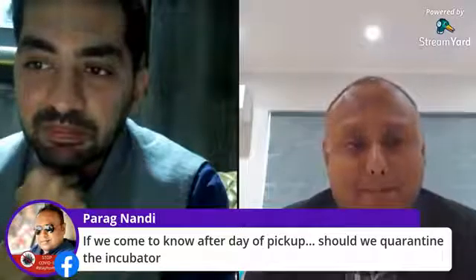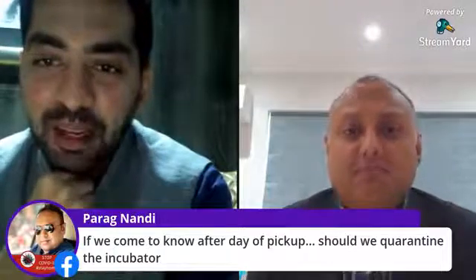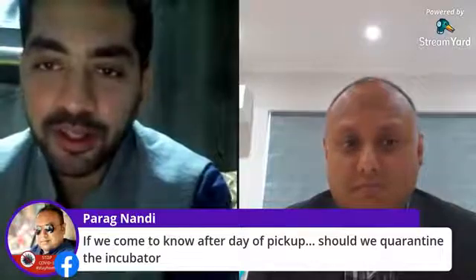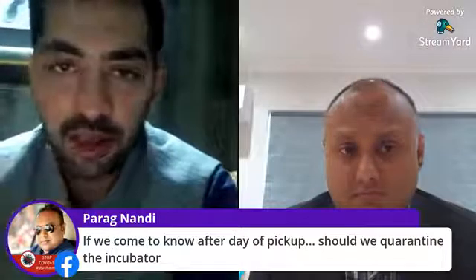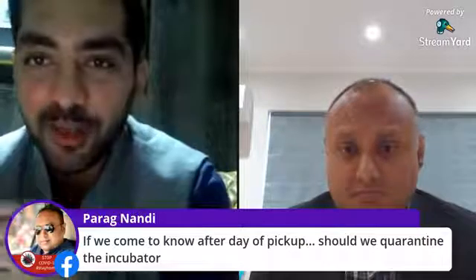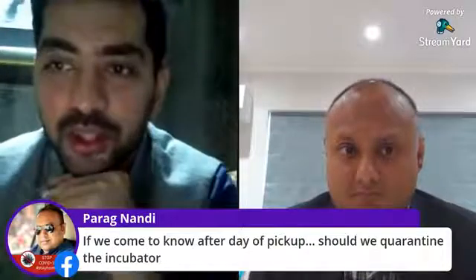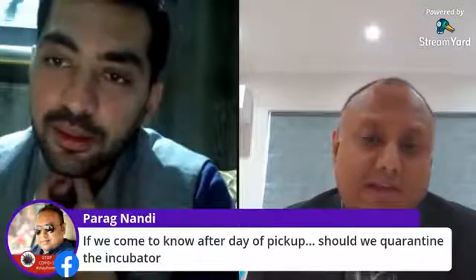Okay, Parag has a follow-up to the same question. If you find out that the patient is positive and you've already cultured the embryos in the incubator, do you quarantine that incubator, or do you clean it, and how do you disinfect, and when can you restart using such equipment? So essentially, if that patient has shared that incubator with other dishes, then I would treat all of those other patients as quarantine patients.